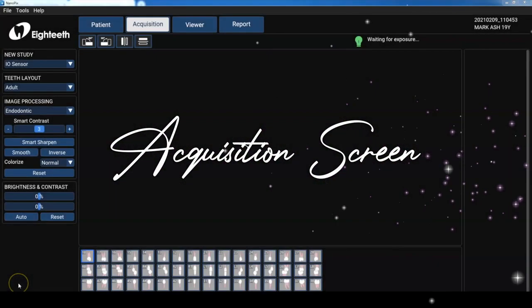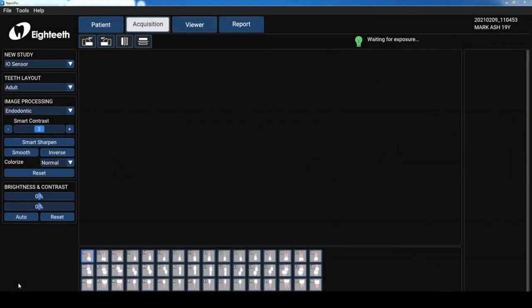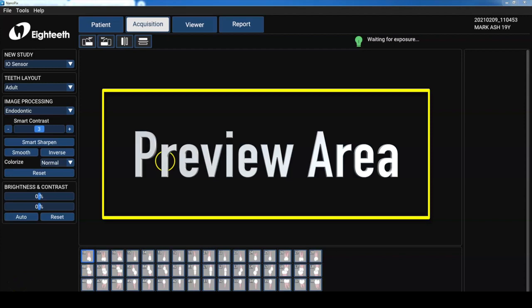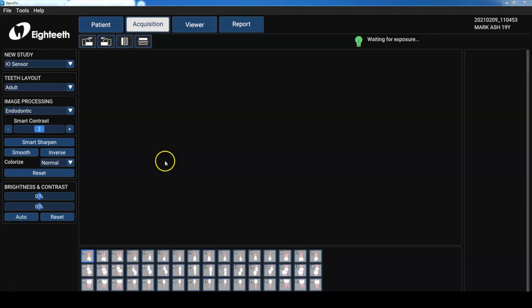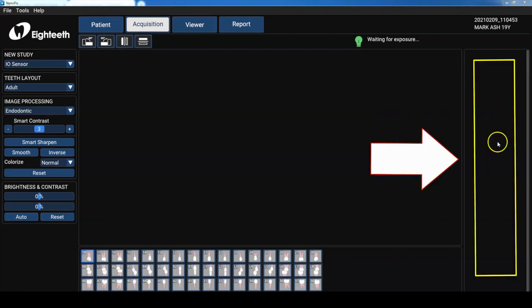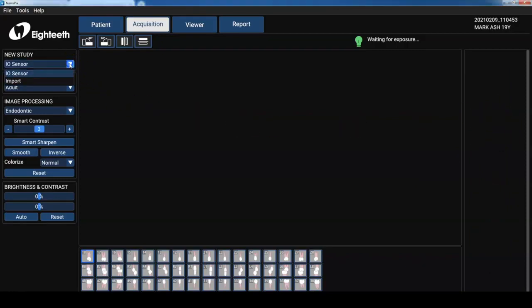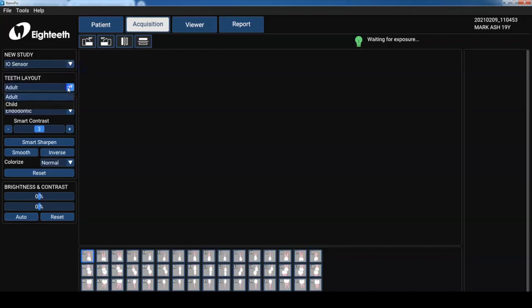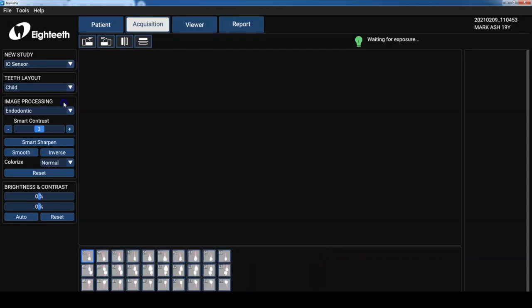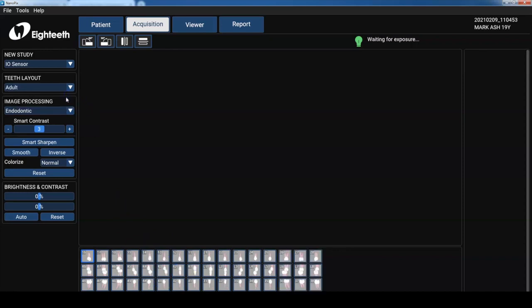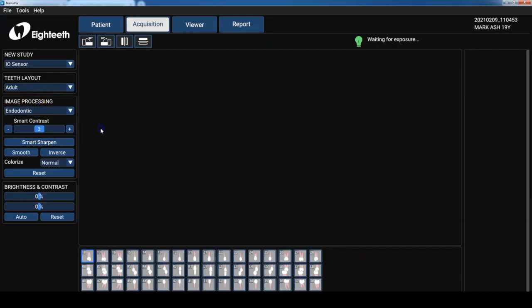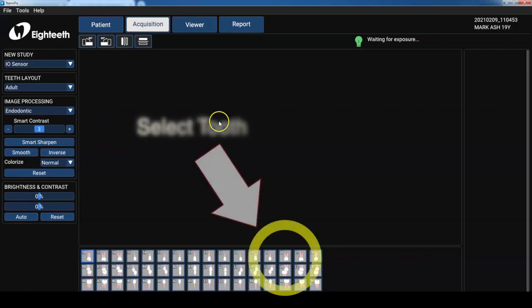Well let's get into the acquisition screen. So right up front there's a large image preview where we see our image as it's captured. And then the panel to the right is used to display thumbnails of recent images. Now we can either use our internal sensor or import previous radiographs. We can set up our teeth to be an adult or child. As you can see here it changes it. And then we can image process using different filters such as endo, perio, restorative. There's a bunch of other buttons. We'll talk about those when we get to the viewer section.